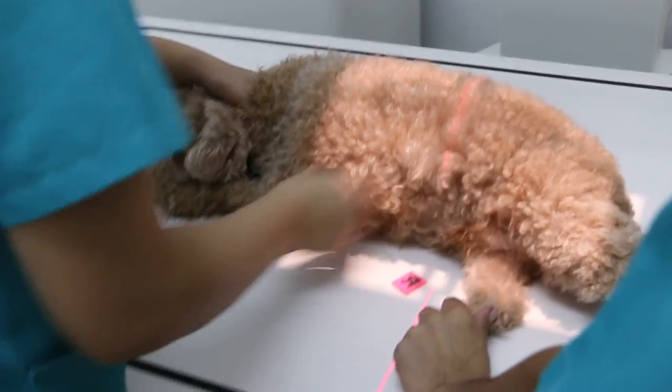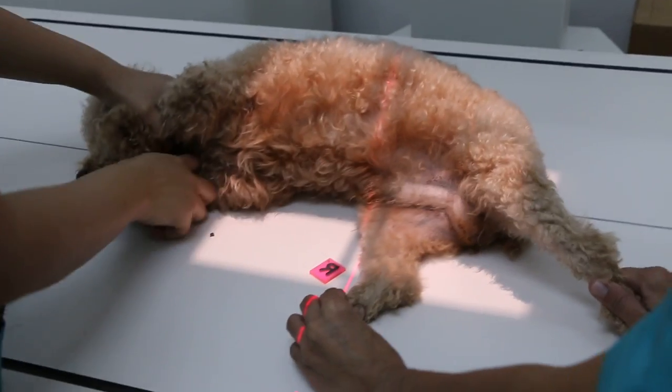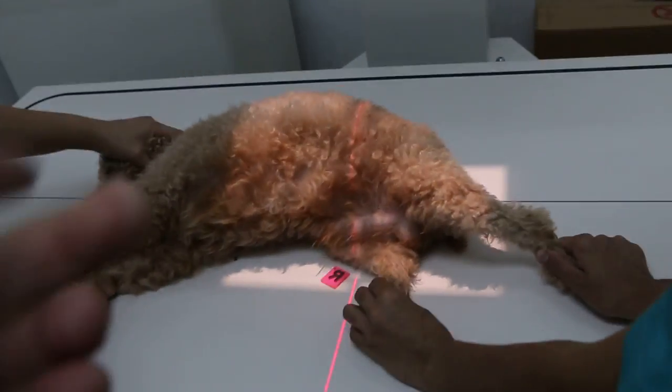ARA — there it is. Yeah, on the right side. Okay, so ARA will refer to the right leg. Okay, so the X-ray will be on the hip here, right?